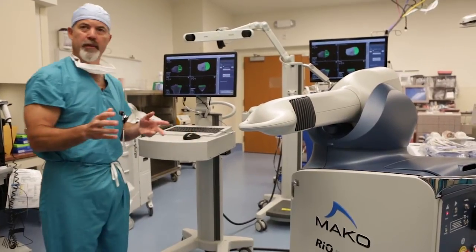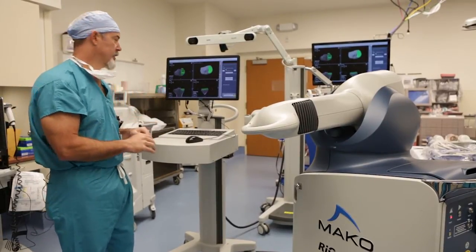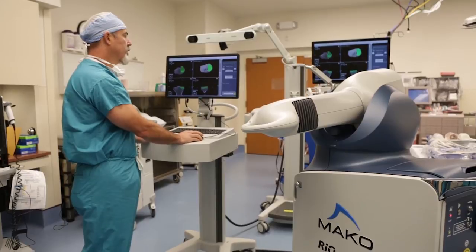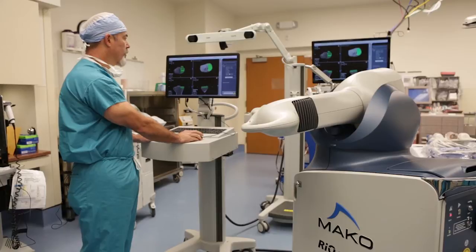Bear in mind this is all pre-operative planning — we have not touched the patient yet. We can modify this intraoperatively if we see something we don't like. At this stage, we're going to go to the drop-down box. I just had medial tibia selected; I'm now going to go to the medial femur.